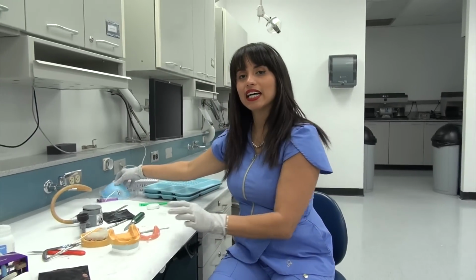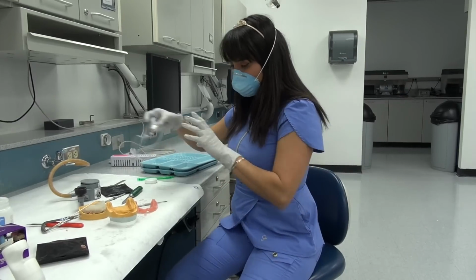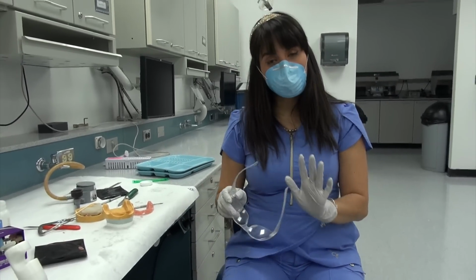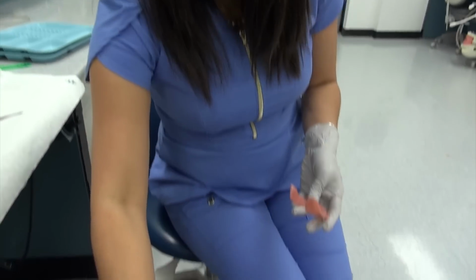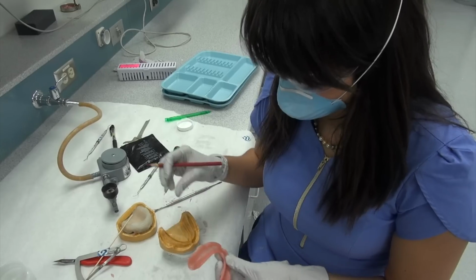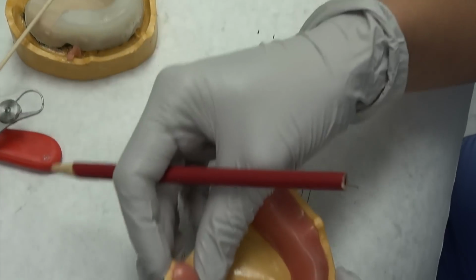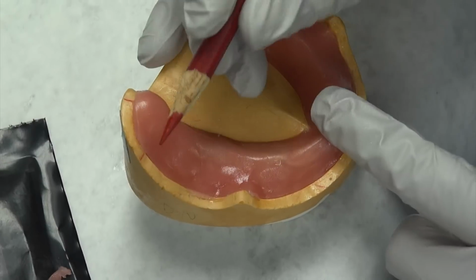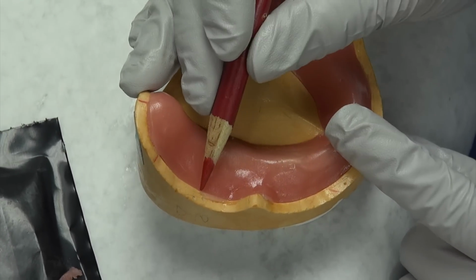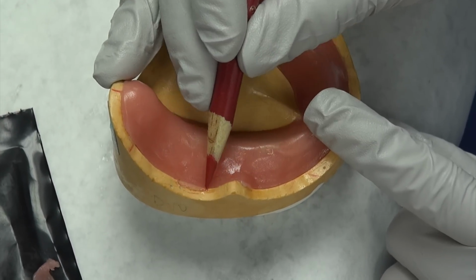Now this is going to be done exactly as I had shown you previously. So I'm only going to do one short corner. Okay, now zoom in here. So the major difference here is because we put the record base up to the periphery here. Sometimes there were times when we had a little bit of what's referred to as flash. Can you see this here?